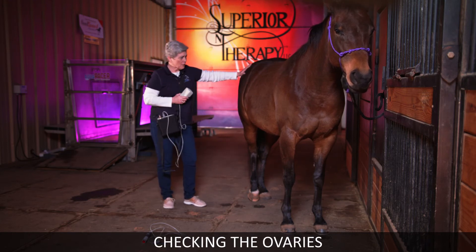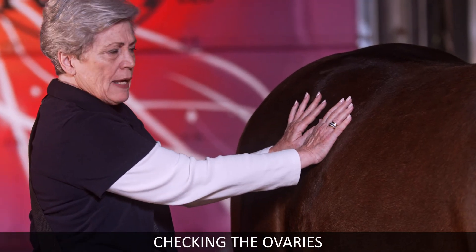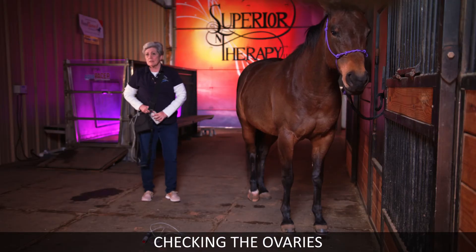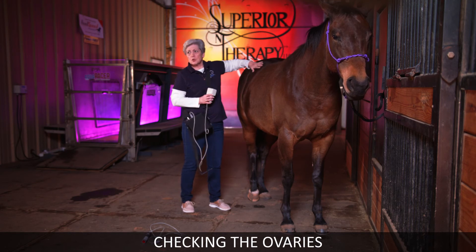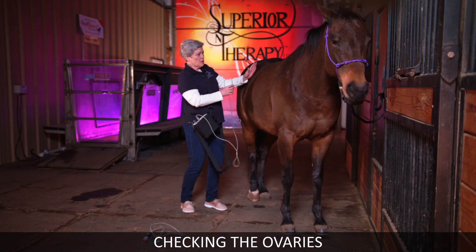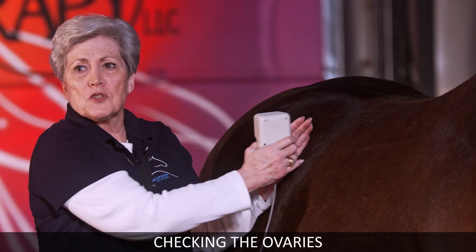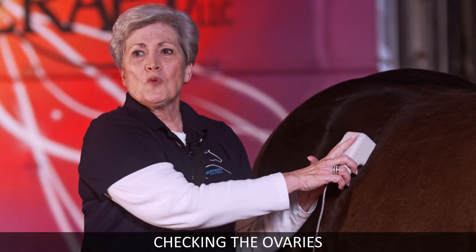If you have a mare, I'm going to show you how to check that. Right here — do your hand in front of it. You may have to spread out if your hands are small, and press on both sides right there. If they've got a problem with their ovaries, they will totally give in. Treat both sides even if one shows more soreness than the other. This helps them drop the follicle so they can do what they need to do. Every time they turn, they're hitting that point for the ovaries, and you're not going to get a good run unless you can get that swelling out. I use the wide head because it's gentler, and with ovary issues you want to be gentle. It's about six inches in front of the flank.